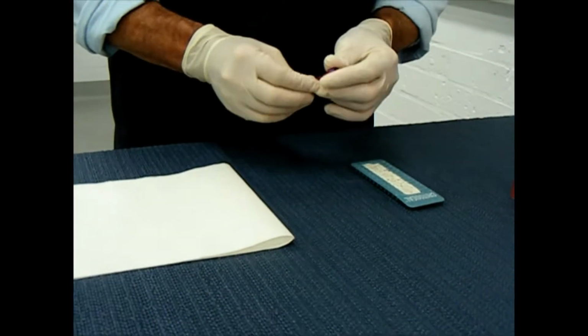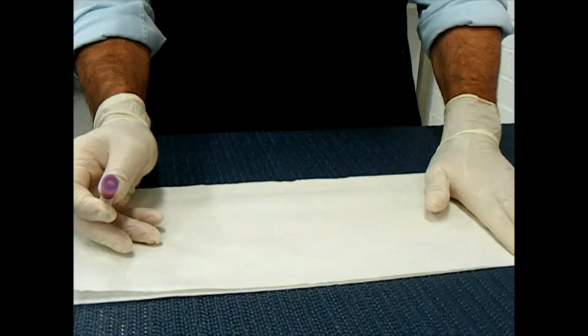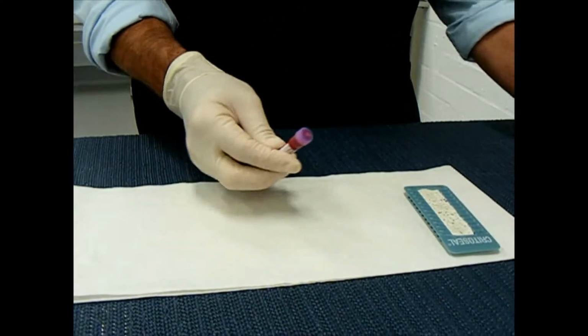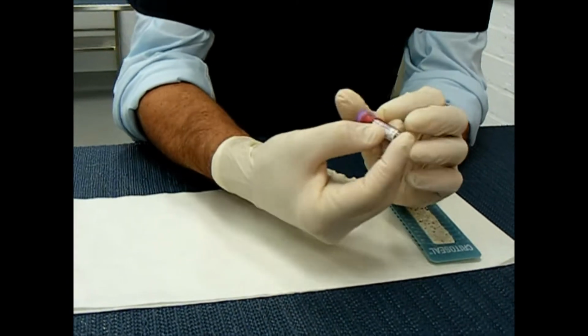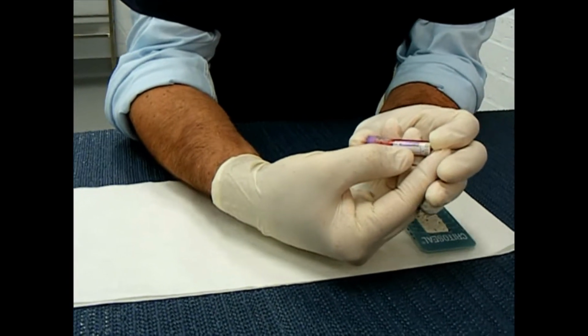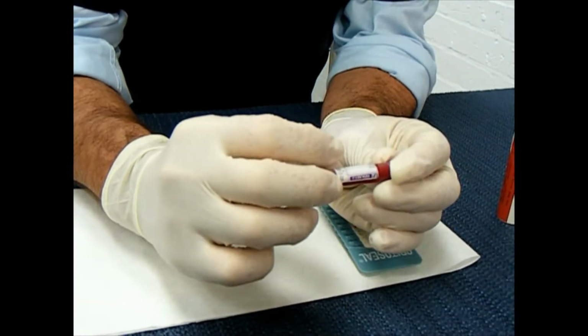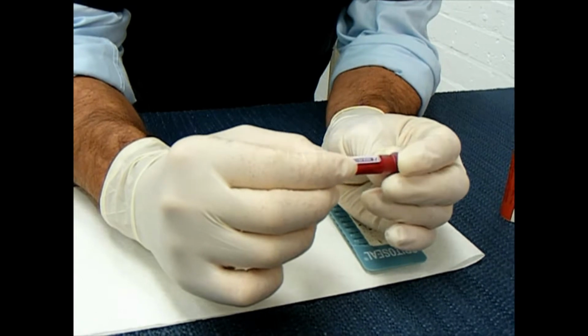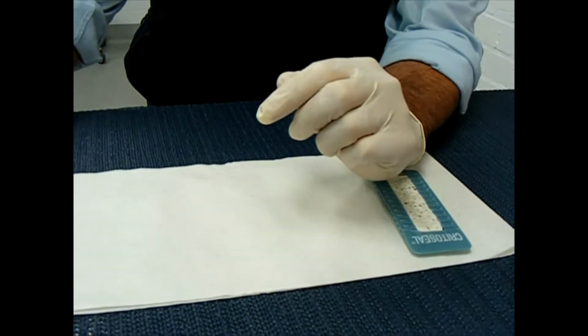I'm going to show you how to do a PCV. PCV is called a packed cell volume. There's a few things we've got here. One is a blood sample, and it's in an EDTA tube. You can see there, and it's a good idea to read the label and identify the patient, so you're ensuring that you've got the right patient and you've got the right blood sample.